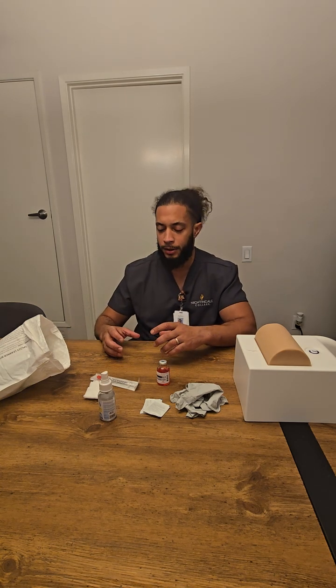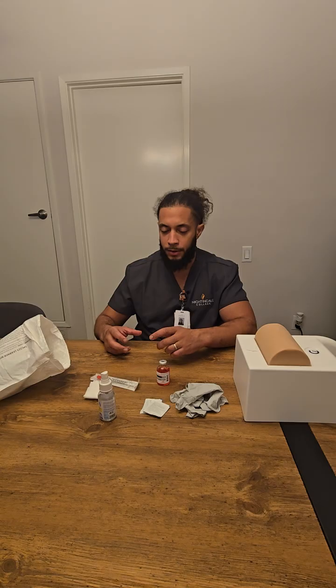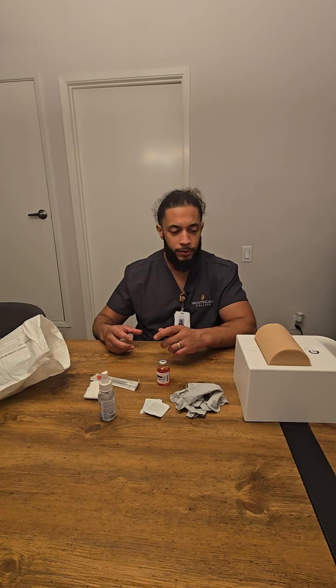Hi, my name is Edwin, and I'm here because your provider put in an order for a subcutaneous injection. Before we start, we're gonna make sure we have the right patient using two patient identifiers. Can you please state your full name and date of birth? The patient stated their full name and date of birth. I'm gonna verify it off their armband. They are who they say they are.